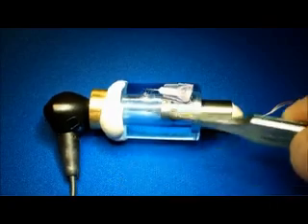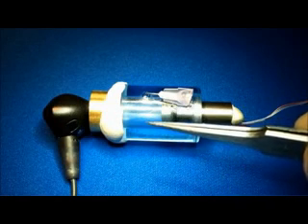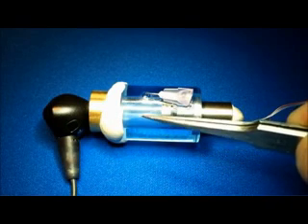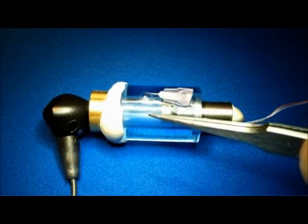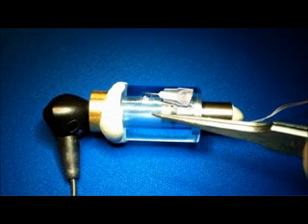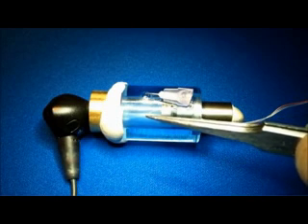Under those conditions, the effective volume that's trapped between the receiver and the tympanic membrane is made a bit smaller, because now the tympanic membrane is not as compliant. If we have a probe signal in the volume while this is all happening, and it's being driven from a constant source here, we will find that the SPL in the volume changes along with the compliance of the tympanic membrane, so that a Stapedius reflex stiffening the tympanic membrane would cause the sound pressure level in this volume to increase.